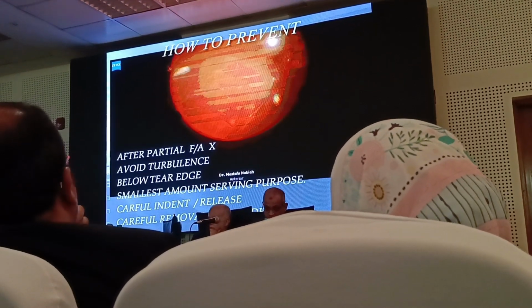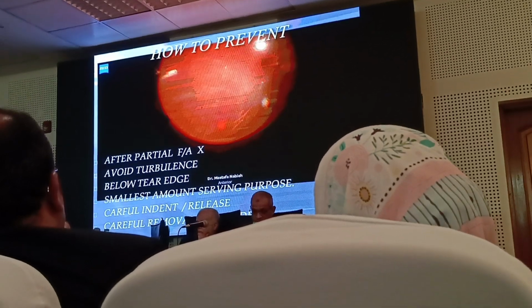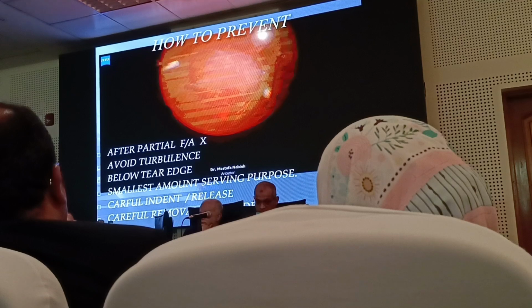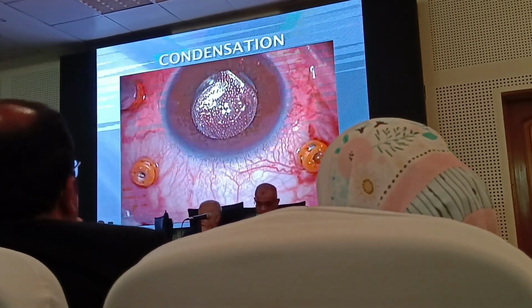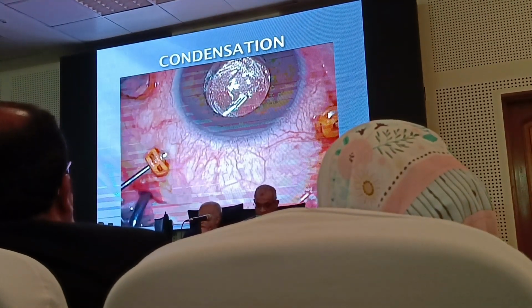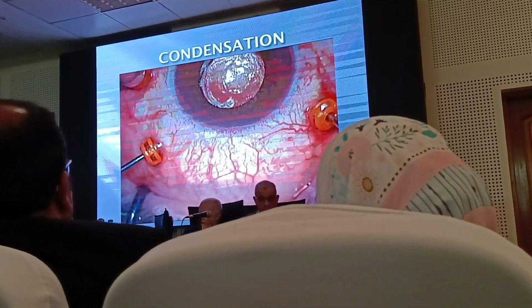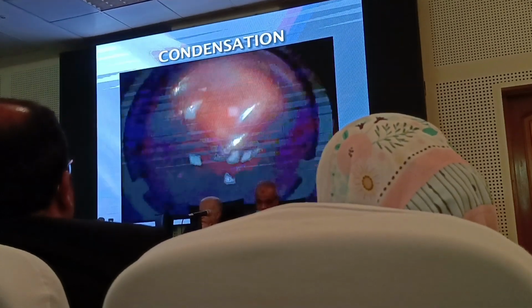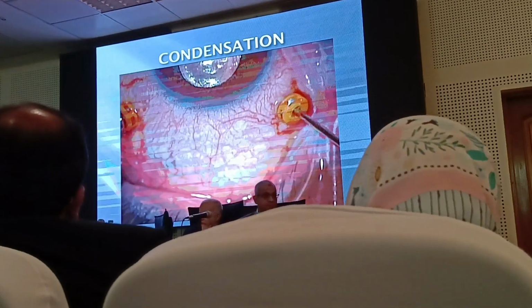And you have, as I told you a few minutes ago, if you want to completely remove it, to use a water drip on the posterior pole at the end of surgery. Having a low boiling point, it evaporates during surgery under air, and it can condense, especially on the posterior surface of an intraocular lens, and sometimes even under the crystalline lens.